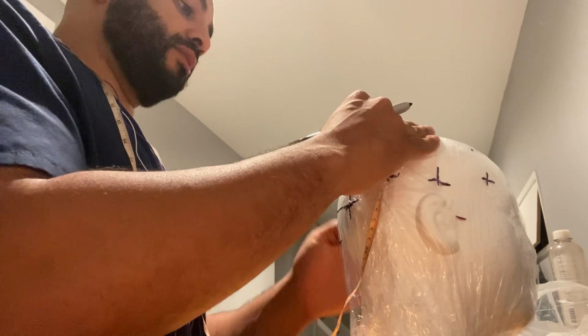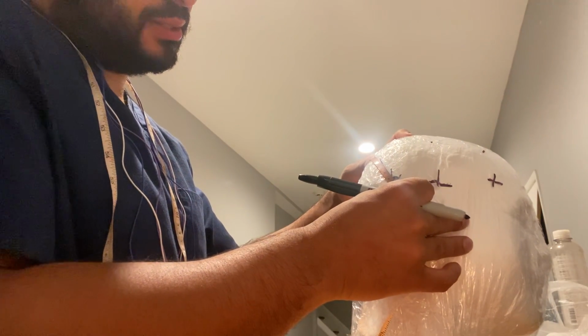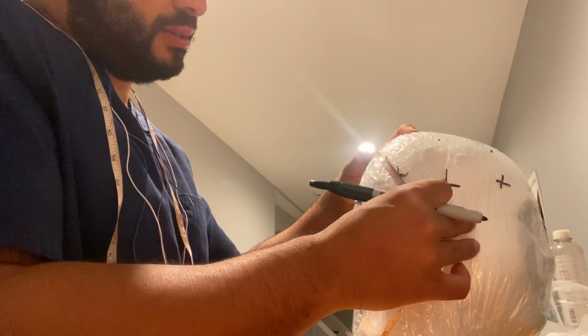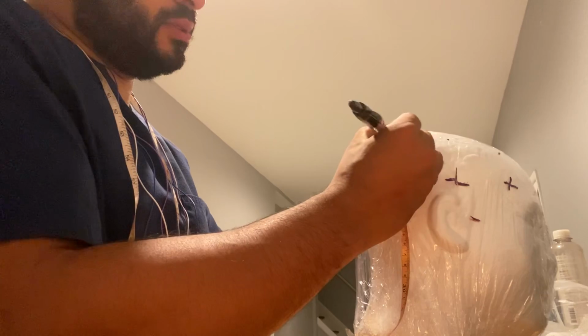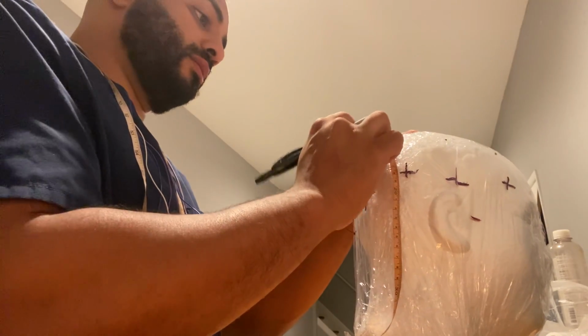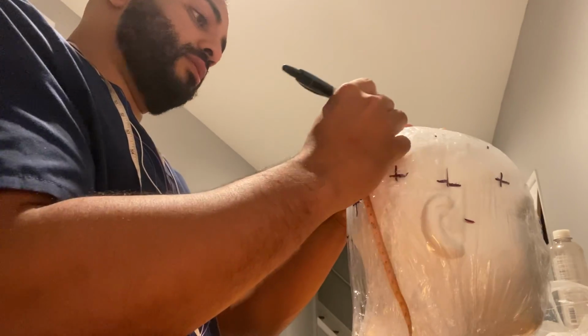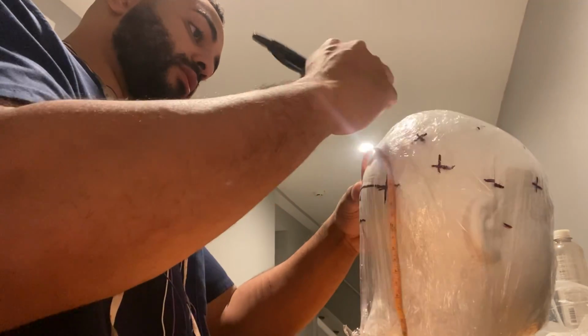from T5 to T6. I get about 18. So that's going to be like 4.25. Make my X here. That'll be like 8.5. Make my X there. And then get my 4.25 right here.